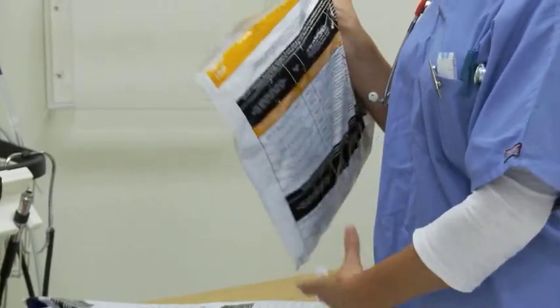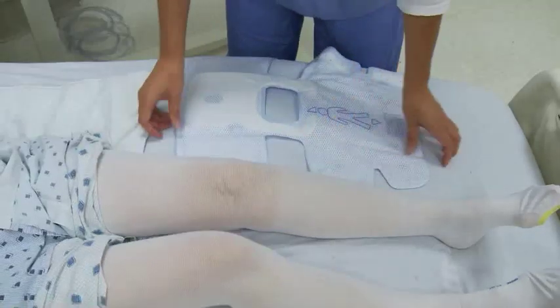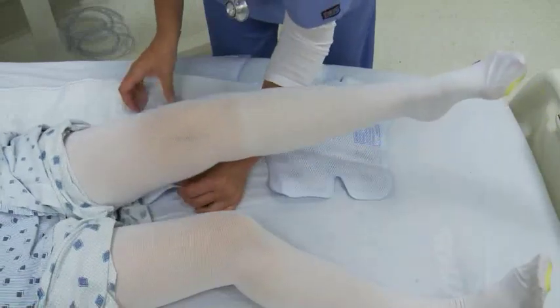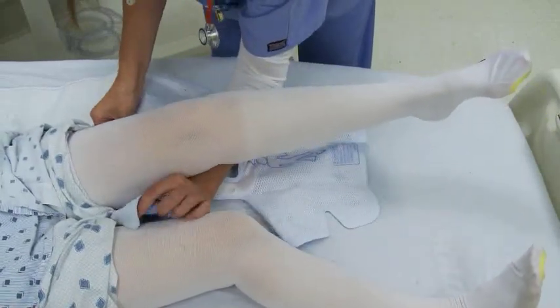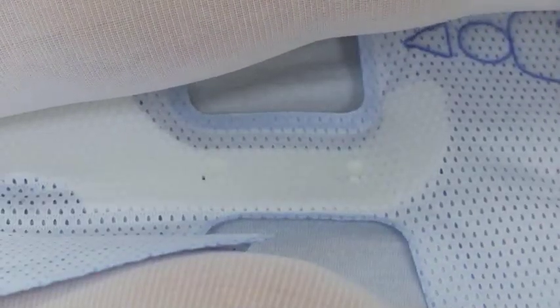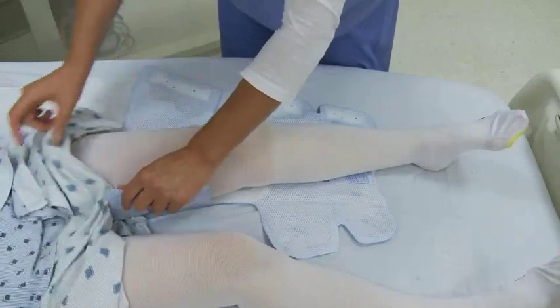Remove the sleeves from the plastic package. Place the side with the printed person silhouette against the patient's leg. Position the sleeve so the blue arrows printed on the sleeve are centered directly behind the patient's leg. Wrap the sleeve securely around the patient's leg, beginning with the side that does not contain the hook tape.